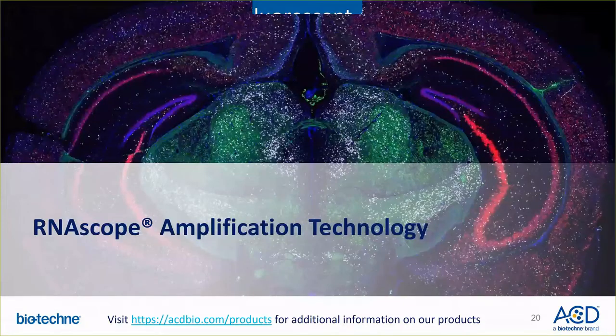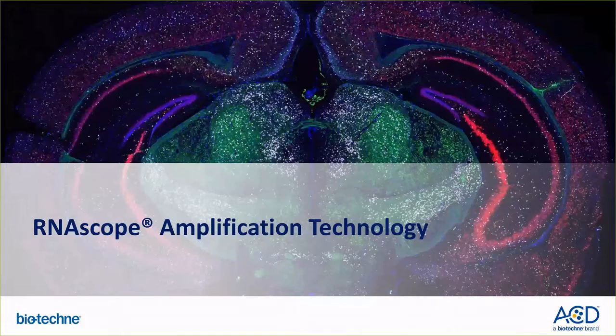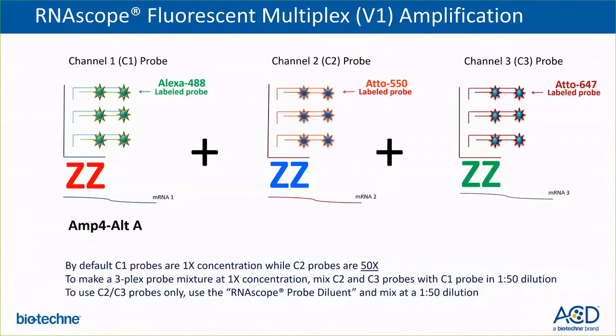In the next few slides, I'll discuss the RNAscope amplification and detection systems specifically for the different fluorescent assays. Presented here is the amplification system employed in our fluorescent version 1 assay. All the 3 probe channels have independent amplification trees, such that the C1, C2, and C3 probes will have their own amplification trees stemming from where the probe has bound the mRNA transcript. The signal can then be visualized from the 3 independent fluorescent labeled probes.